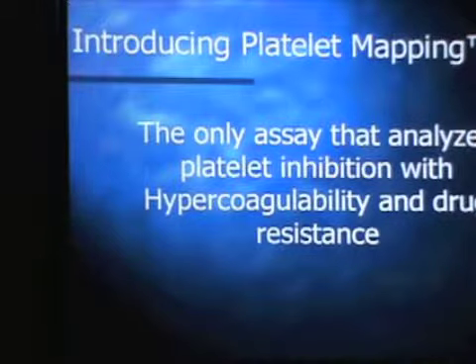Okay, so AHA guidelines post-stent, their society says aspirin and Plavix post-stent, every patient. Every patient gets 325 of aspirin and 75 of Plavix. Every patient. So my question to the cardiologist is, hey, we all metabolize the drugs differently. How do we know that's the right amount? And they have no way of knowing, except with platelet mapping.